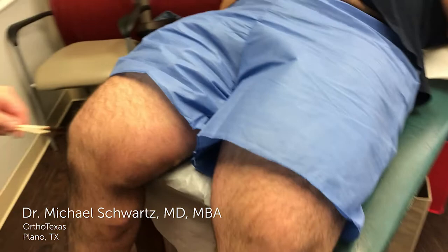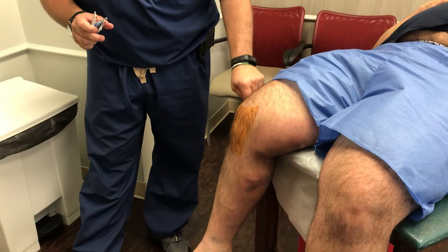We'll do this in two steps. First I'm going to clean the knee and then numb it up, then let that work for a few minutes, probably about 10 minutes or so, and then I'm going to come back in and do the actual procedure.